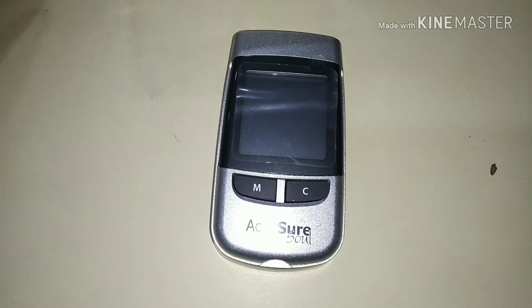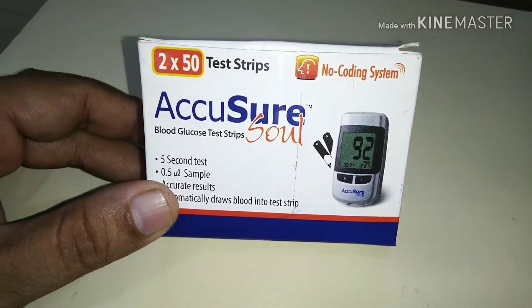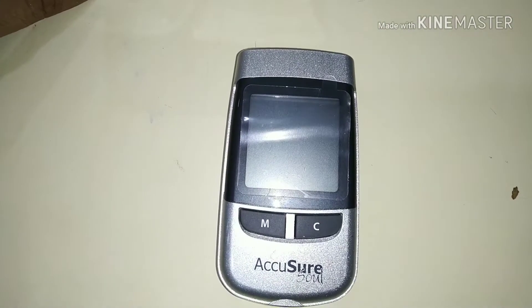This is a blood sugar machine which you can use to check your blood sugar instantly. Today we will learn how to check your blood sugar.